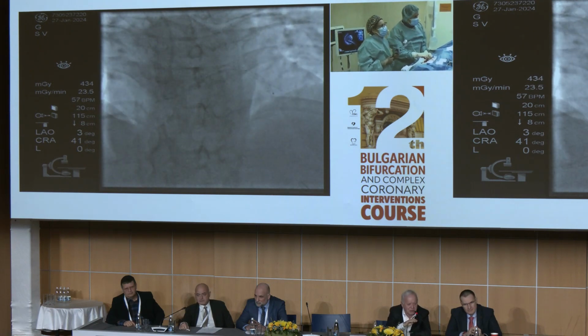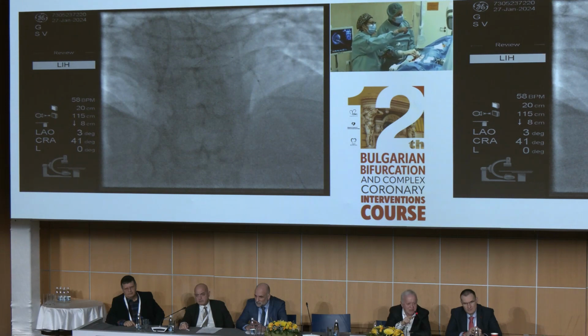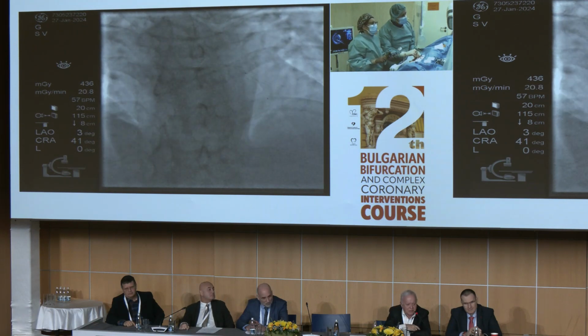Here comes the sun. Position it inside the stent. Yeah, a little bit further. Inside the stent, further. I'm a bit afraid of it. You inflate now, at 12 atmospheres as usual, as the first ones.